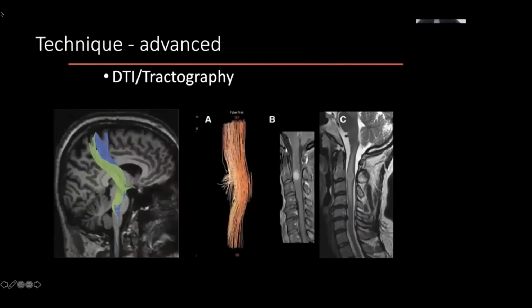We have a technique in MRI called diffusion weighted imaging. You may have seen this. You guys presumably have seen diffusion weighted imaging. Just yell out one or two areas where you may have seen people use diffusion weighted imaging, if any of you have, outside of the spine. Hi, so I have seen DTI used for two things: for traumatic brain injury, and I've also seen it for tumors in the brain. Yes, absolutely.